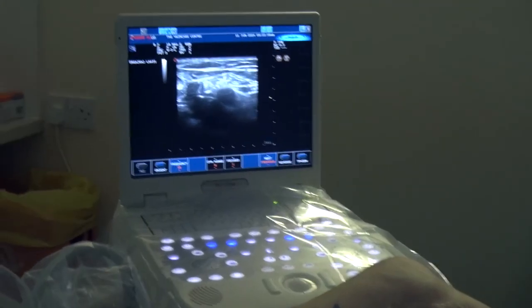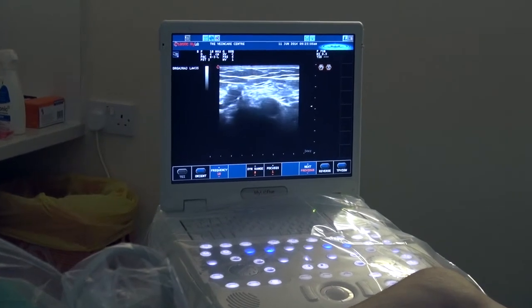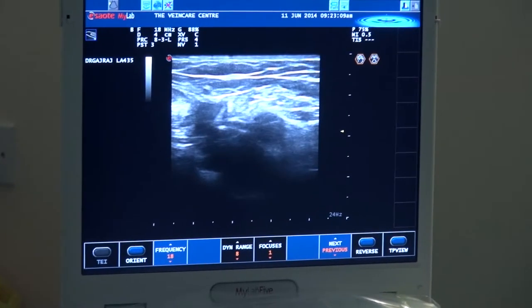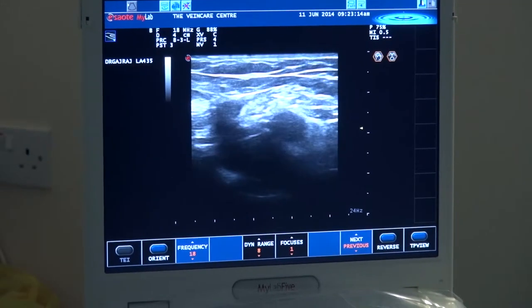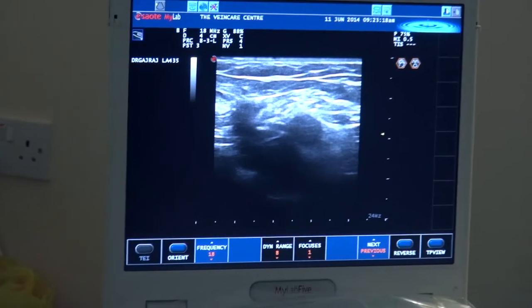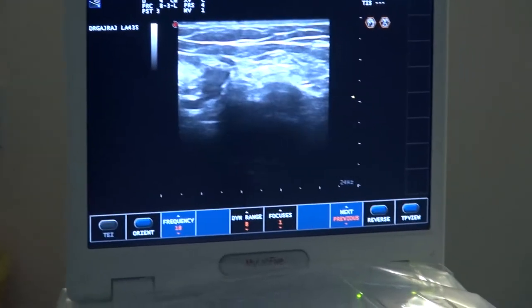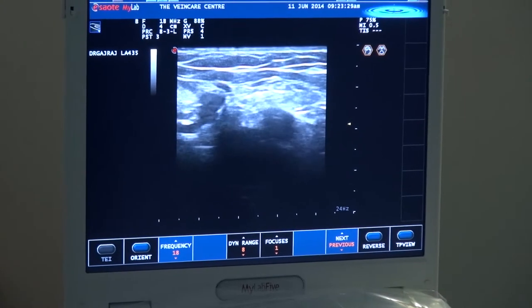Here we see the confluence of the great saphenous vein at the top left with the femoral vein in the middle, and some people say that image there in the middle looks a little bit like Mickey Mouse. You can see his face in the middle and you can see his two ears. Mickey Mouse's right ear on the screen is pulsating — that's the artery — and his face is the femoral vein and his left ear is the great saphenous vein.